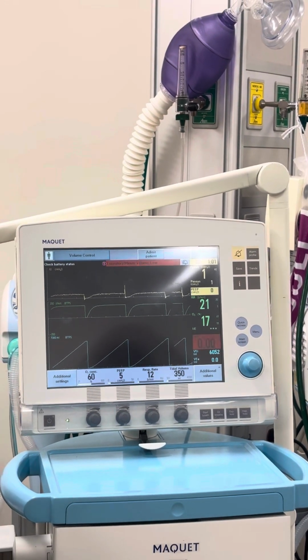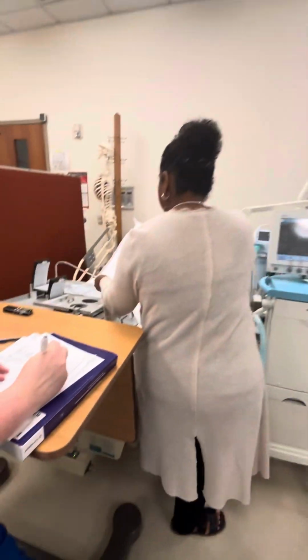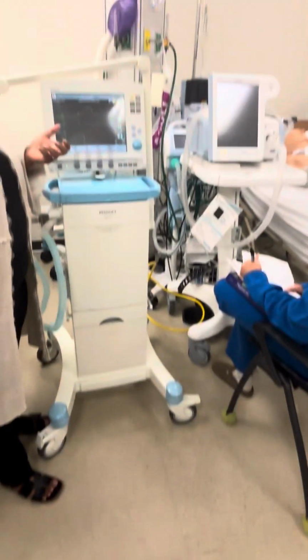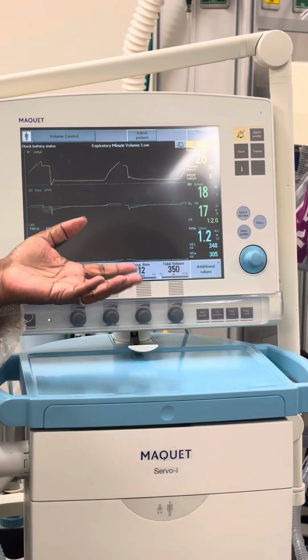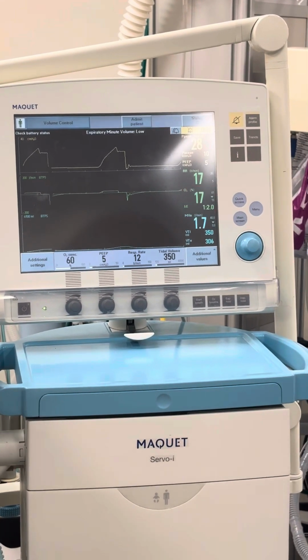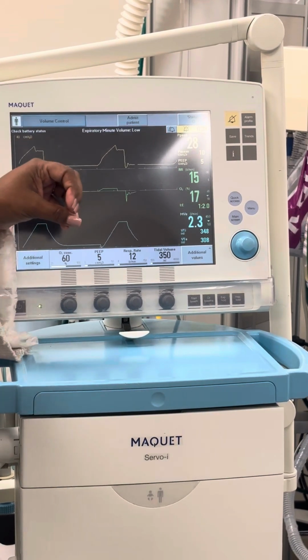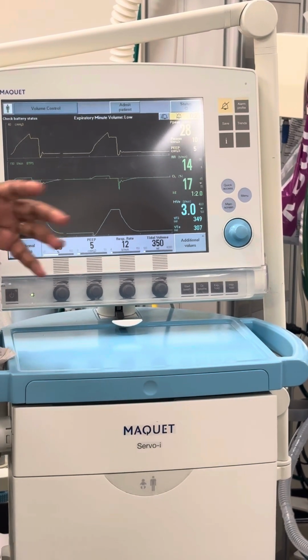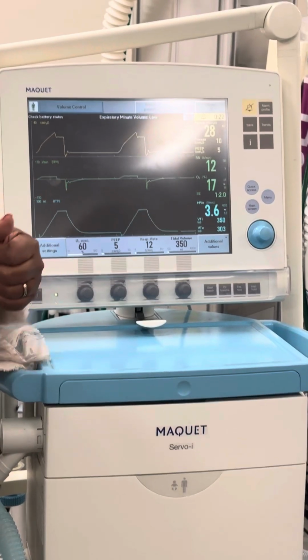And then I do what? Place it on the patient. Put that on, and then I can actually do what? I'll go ahead and I can actually do my alarms if I want to, or you could do your monitoring. All right? I'm okay with whatever you want to start. I just want to show you where alarms are though, alarms and monitoring. So everybody's okay up to this point. Know a little bit of the differences between the two ventilators. There are a couple things that this ventilator does not have that one has the bells and whistles on. But I need y'all to understand when you're going to different clinical sites, we have to show y'all a couple different ventilators because not all clinical sites have the same ventilator, right?